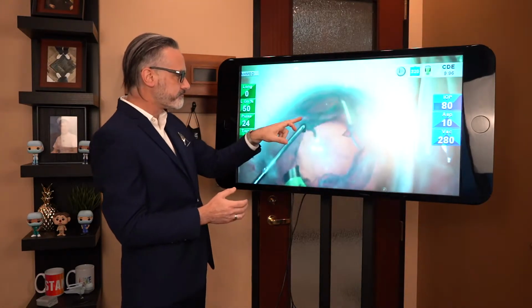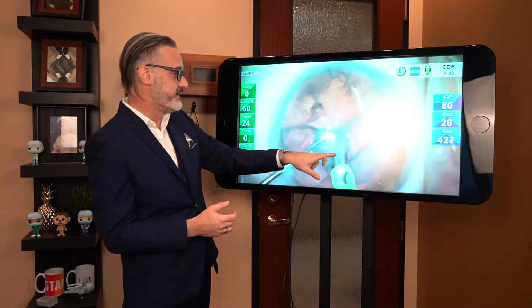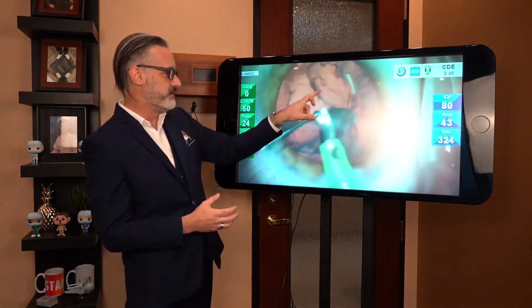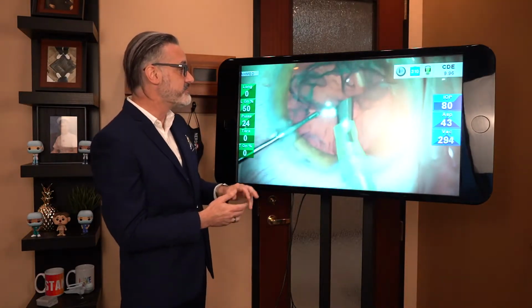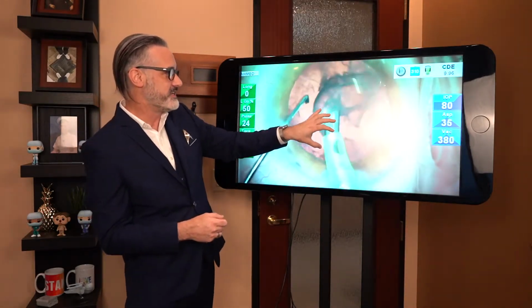Now after the cataract itself has been removed with the lens, the doctor is taking the vacuum and getting all the other part of the lens out, that's all that's left, and then using the little hook tool as needed to extract it from the side.